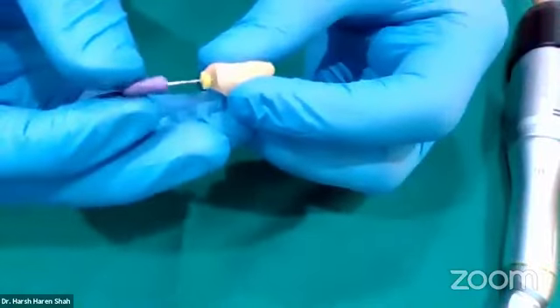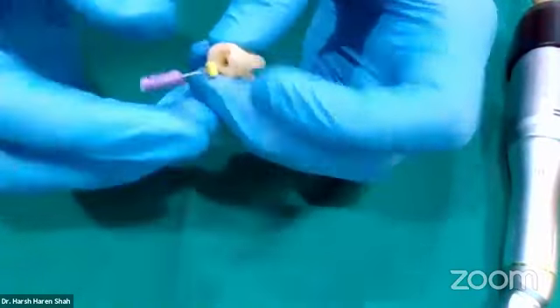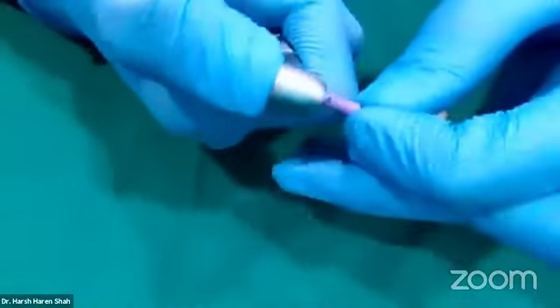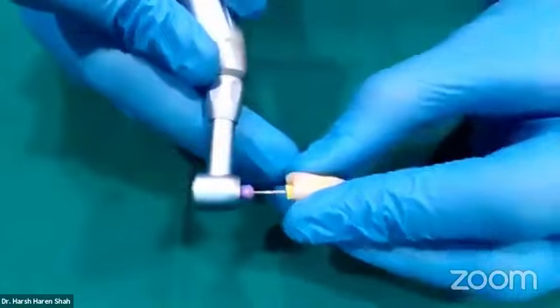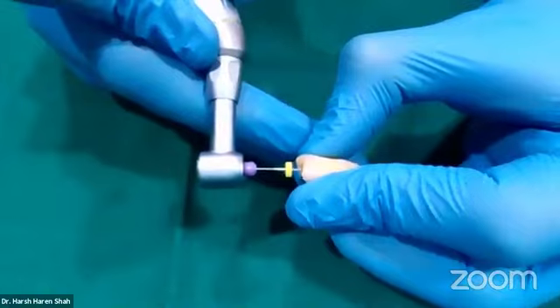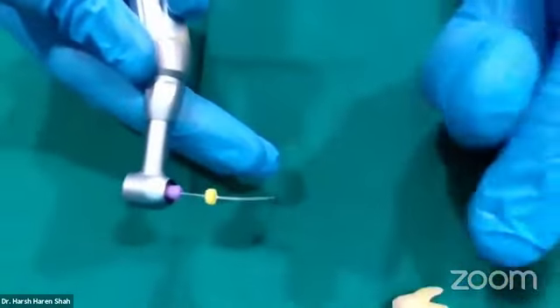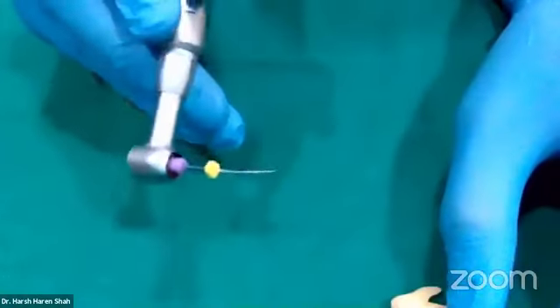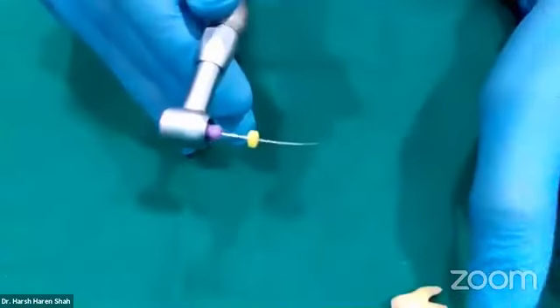So what we'll do is I'll insert this file. My first 10 number K file, the first elephant in the picture, has reached up till the full working length. Now you need to hold this file slightly, with just one finger is okay. You take your handpiece and you insert the file. Now you just activate this handpiece. When you activate, the file is oscillating. I'm sure you can hear it. Let me also show it to you. I'll just curve this file so you can see it much more clearly.